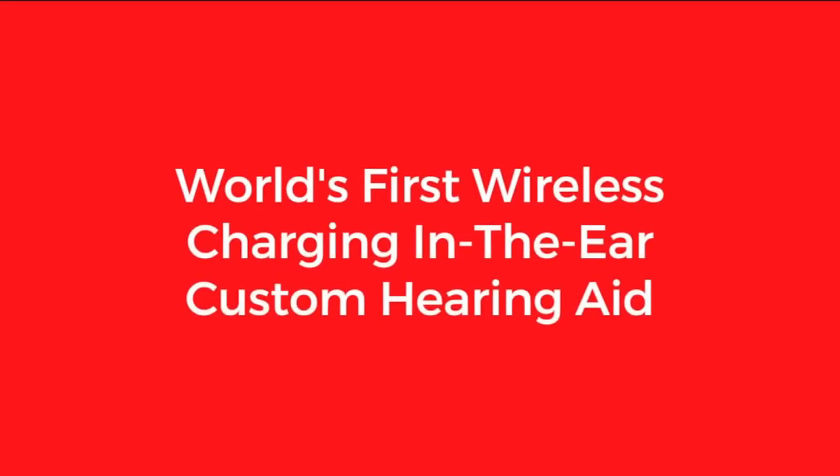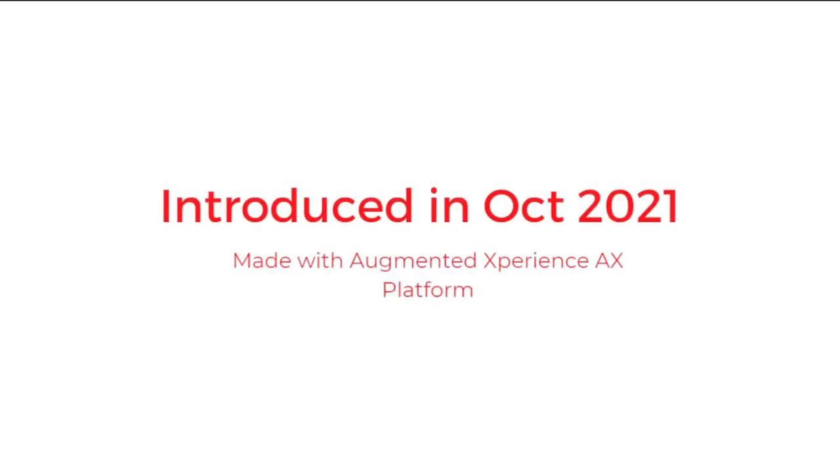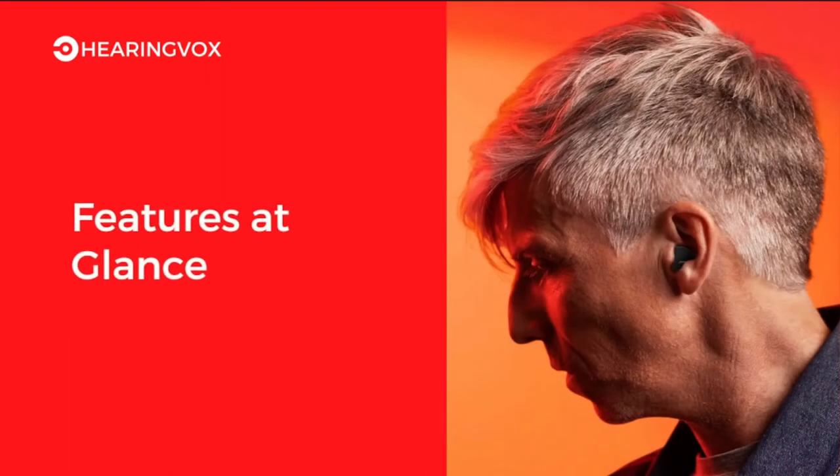The Signia Insio Charge&Go AX is the world's first wireless charging in-the-ear custom hearing aid. It was introduced in October 2021 and was made with the Augmented Experience, that is the AX platform. Now we will be overviewing what features are available in the Signia Insio Charge&Go AX.